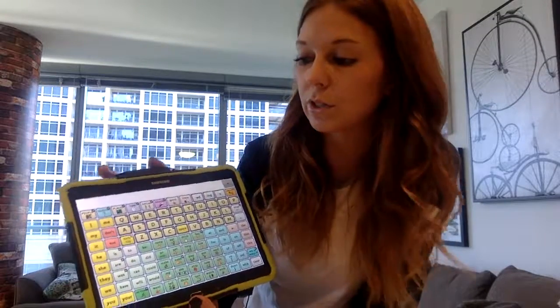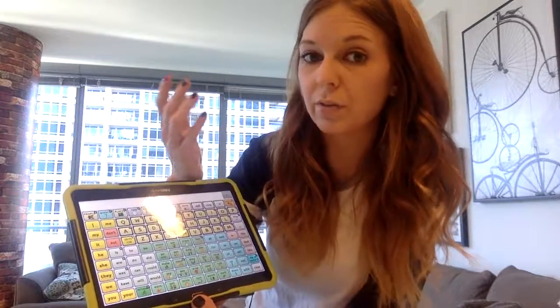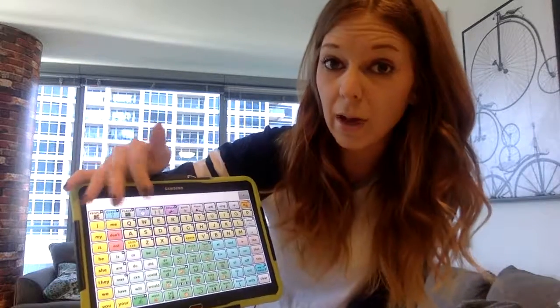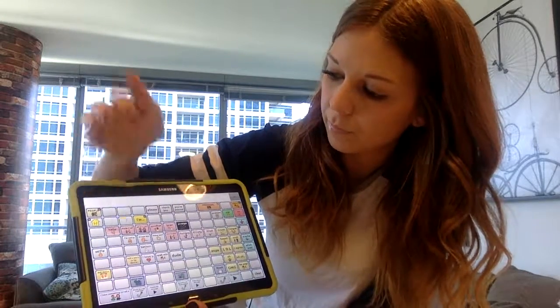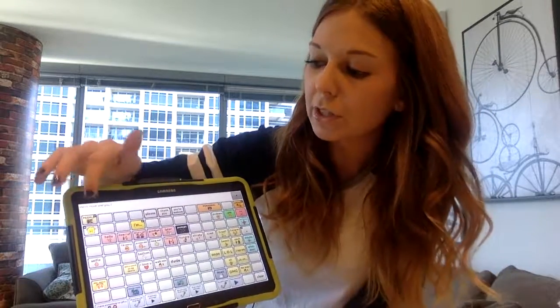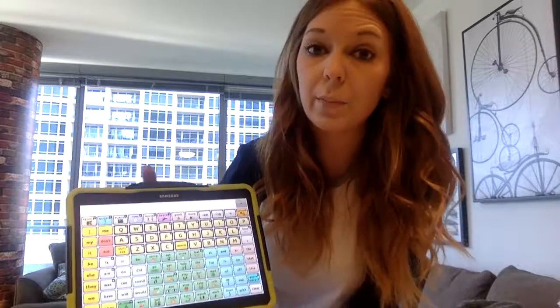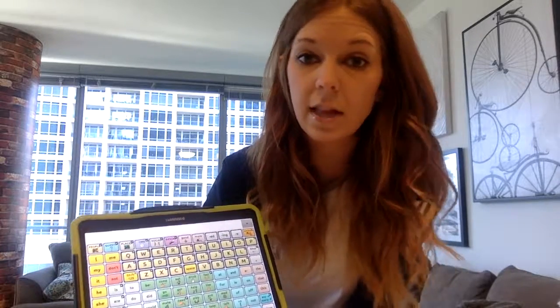So when I'm implementing this with the children, I will actually talk to them using their language. I'm still using my vocal output that I have, but I'm also using their language, which is using the device. So if I was saying hello to them, I would actually be touching their device and saying, hello. How are you? So you're actually just letting them know that they're not the only ones using this. You feel comfortable using it. It's a great mode of communication. It's not just theirs.